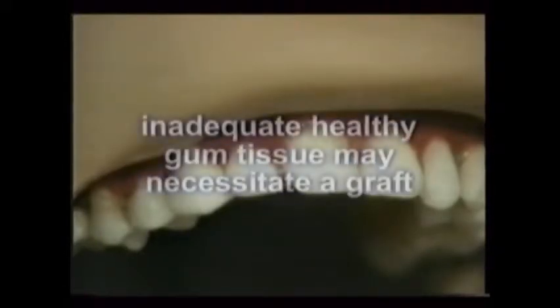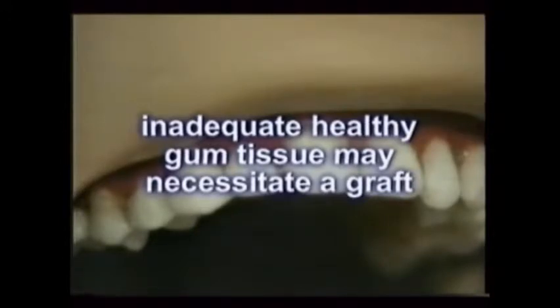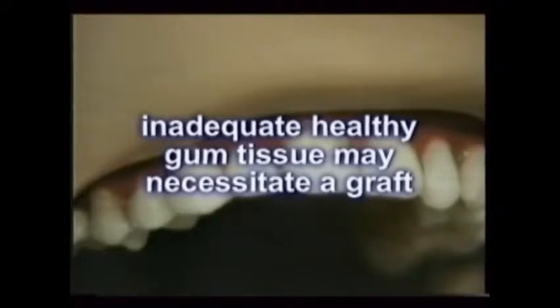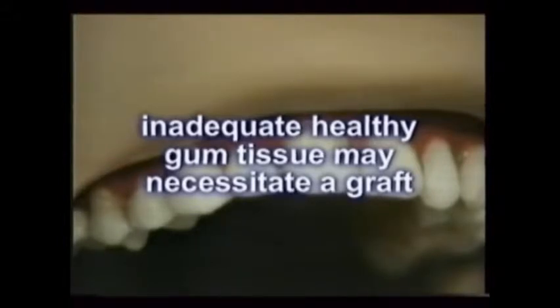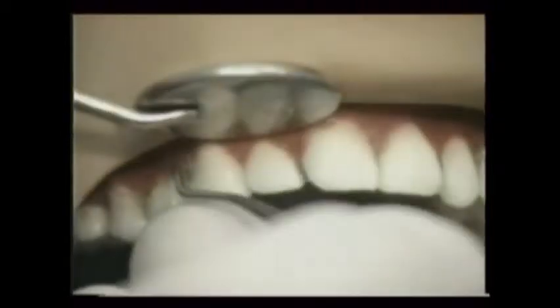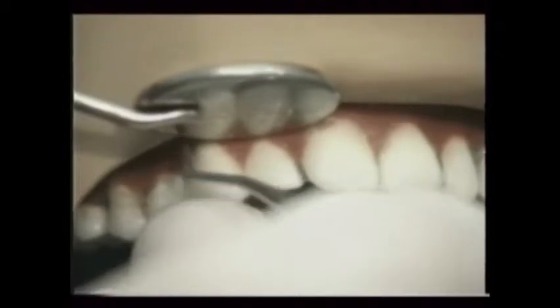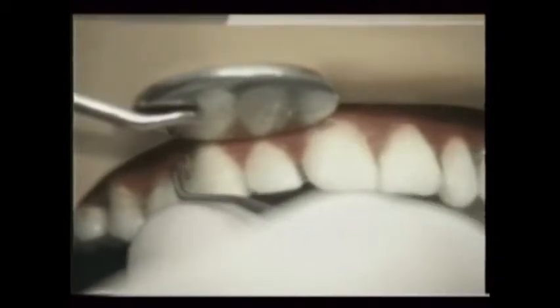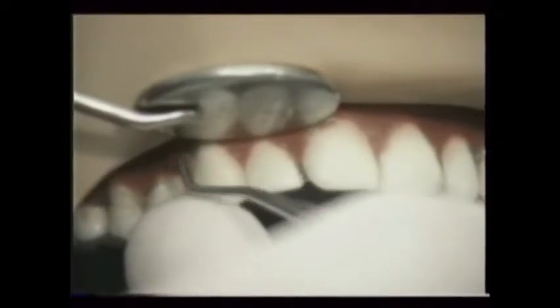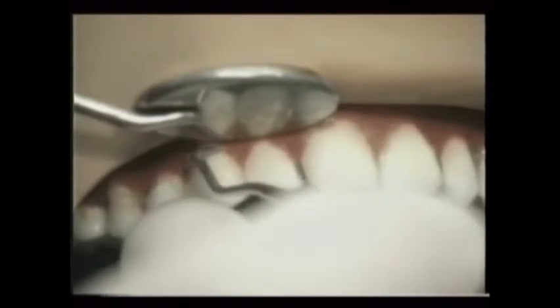Occasionally, inadequate healthy gum tissue may remain. The doctor may elect to perform a graft by shifting an adjacent layer of gingiva over the site, or by relocating a thin sheet from the roof of the mouth or some other healthy area. Once the diseased soft tissue is removed and the gums properly re-contoured, the surgeon directs attention toward the surfaces of the teeth, using scalers or an ultrasonic wand to smooth them of any deposits.